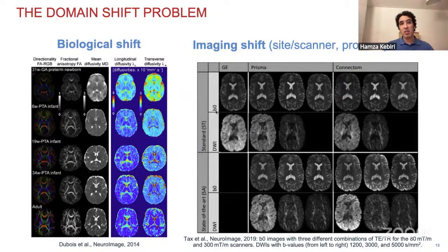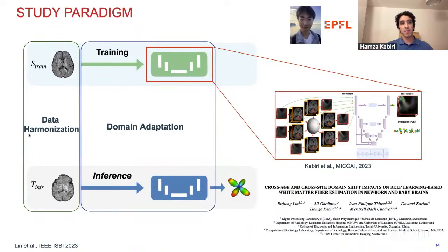So this is the typical problem here, and we basically dealt with it with two methods. I think namely the domain shift problem can be tackled from two points. Either you try to work on the data and remove what should be removed, so that the data sets don't have the component, or the component of scanning and acquisition is somehow reduced between them. Or you can work on the model.